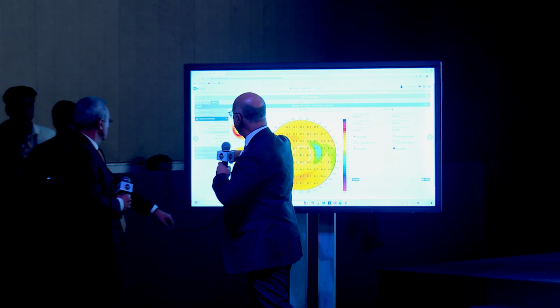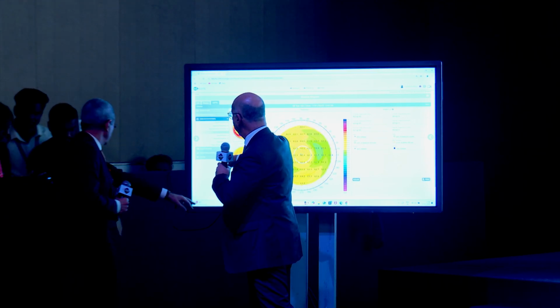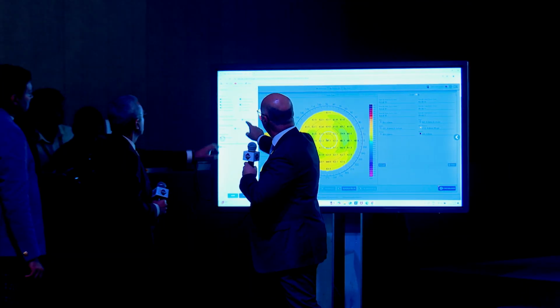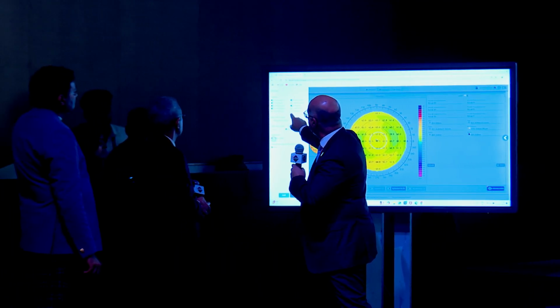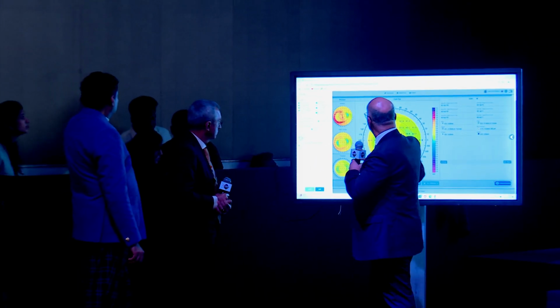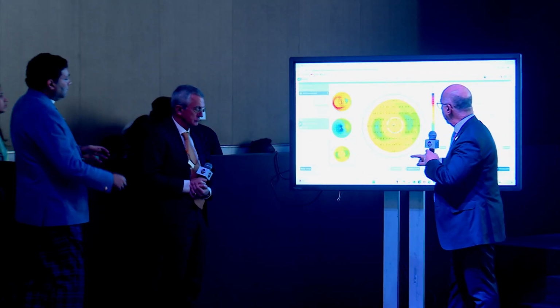This is very beautiful to show. Get down. Yes, display setting. And go back to the posterior and mark it, the posterior. No, the last one. Yes. Yeah, this one. Yes. So, back again.